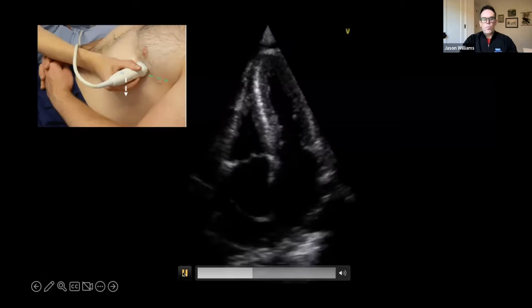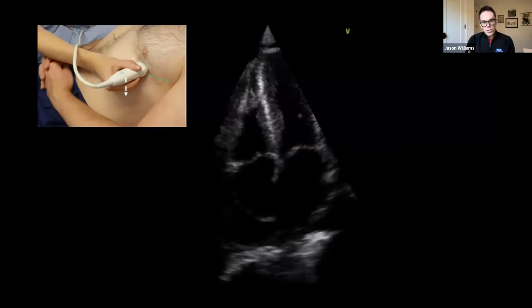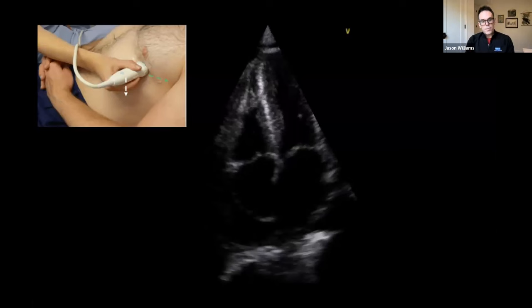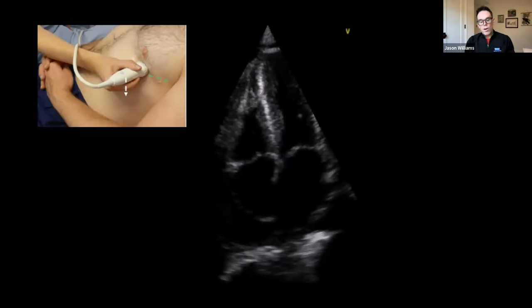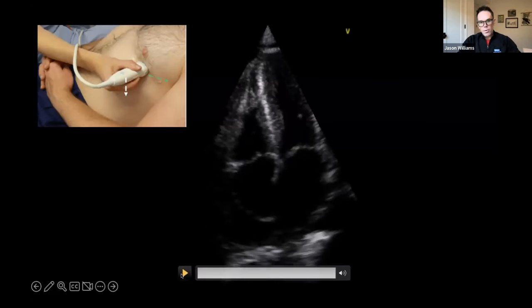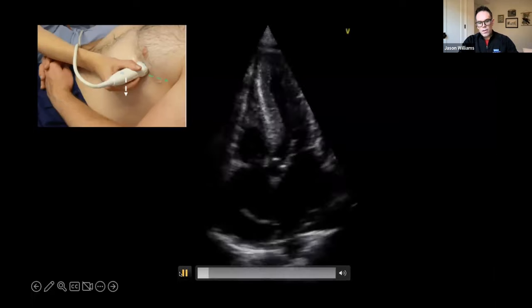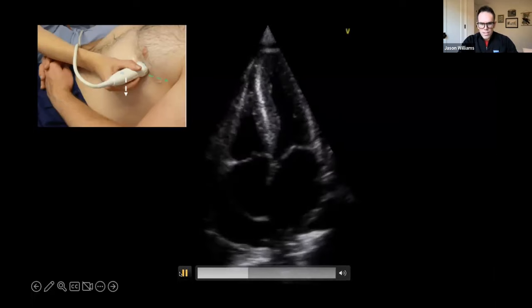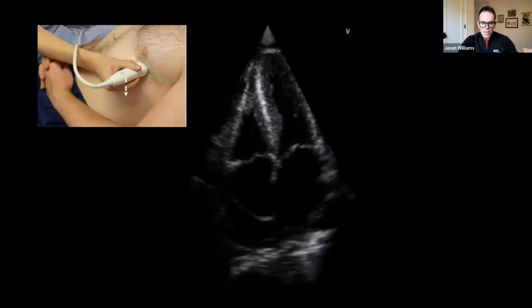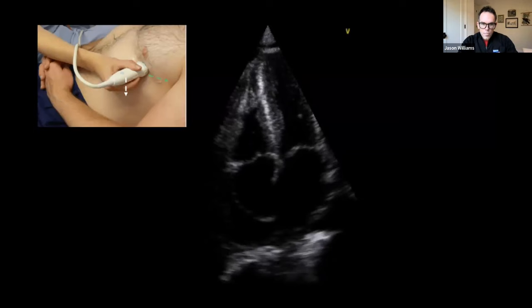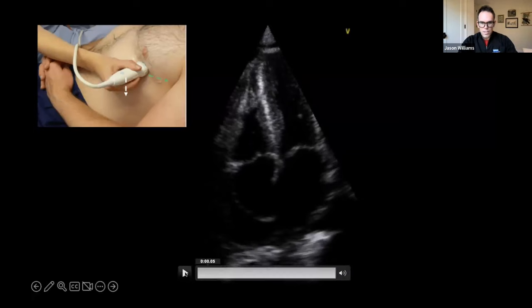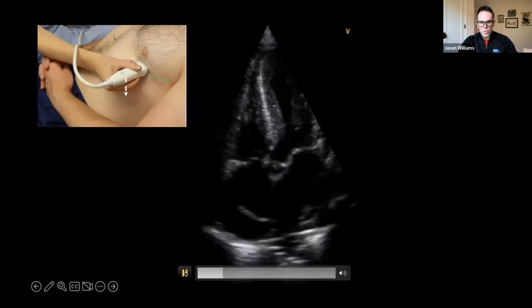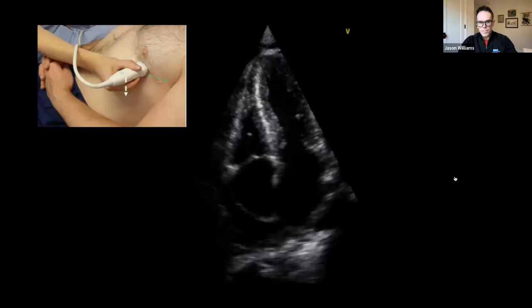So ideally you actually have an EKG on here, or what I do is I'll actually slow it down and look at that free wall of the right atria to see, does it collapse when the tricuspid valve is closed? So in other words, it's normal for the right atrial wall to collapse when the right atria is contracting. When it's contracting, your tricuspid valve is open. But if you see that right wall collapse while the tricuspid valve is closed, that means the pericardial effusion is crushing your right atrium. And that's a sign of early tamponade. And similarly, we'll look at the free wall of the right ventricle and see if there's any collapse over there, which is, it's not obvious to me in these images that it is. But the sensitivity for us looking at tamponade is pretty low. So I haven't certainly haven't ruled it out here. Okay.